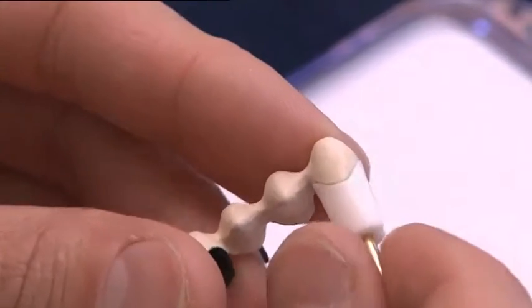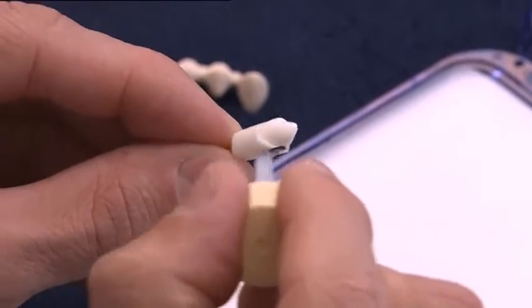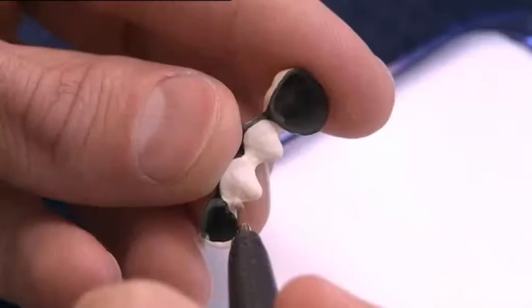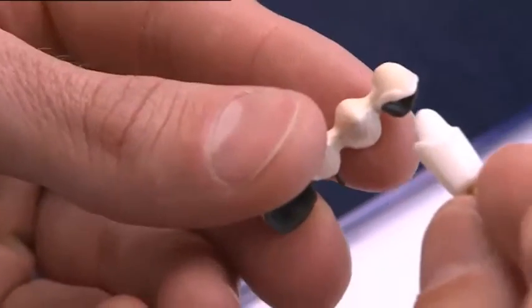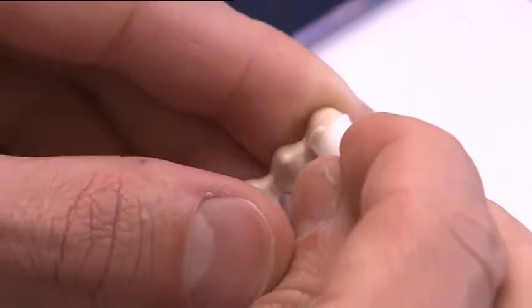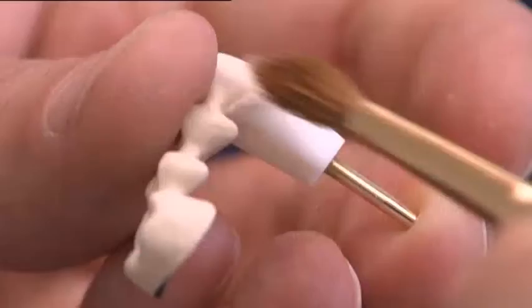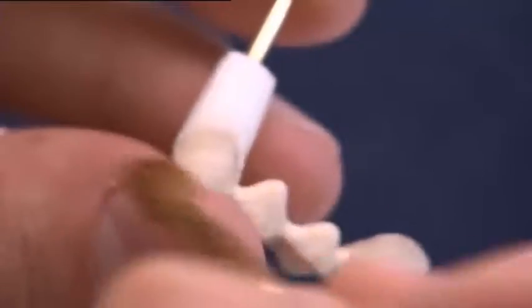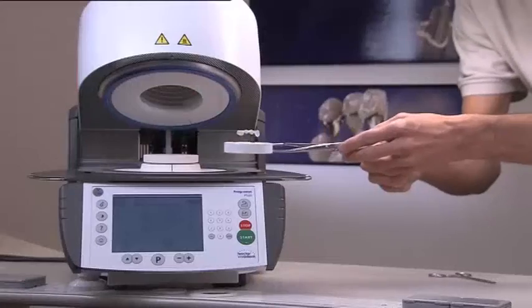Once the model die has been isolated again with IPS ceramic separating liquid, supplement the missing areas and fill the gap, which is formed after the first firing, with margin material. In order to ensure ideal fit of the shoulder, remove the framework with the dried shoulder material carefully from the die and fire.